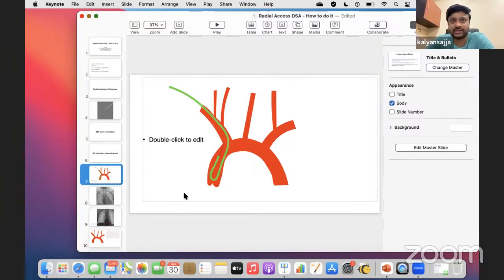We have treated one case several times for vasospasm because there are only so many access sites, right? So I used the snuff box twice, radial twice, then high radial, and then switched to left radial. I did the left radial for a few days of milrinone, and after day 8 or so, the vasospasm broke by itself. Whenever I did the treatment, it would last for several hours and then start becoming weak. So in cases where you need multiple punctures, left radial is a great way. We actually published on the left radial access.